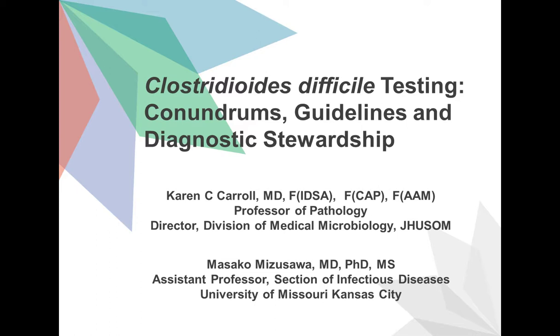So that is a very good question and sums up exactly the conundrum that faces labs that really have studied this in their own environment and prefer to use NAT tests combined with some sort of computer decision report to improve testing. And by the way, I think even though some of these other test methods are insensitive, it still makes sense to try to reduce inappropriate testing across the board, regardless of the test method that you're using.